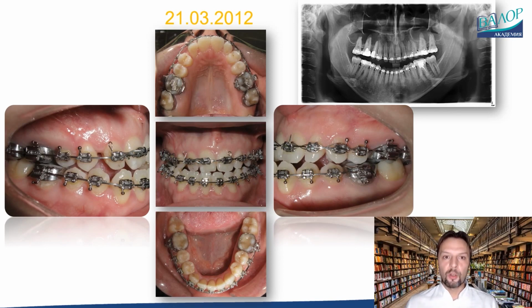This is an obligatory stage in any of my treatments to analyze what corrections are needed to finalize it. Control impressions are of utmost importance for orthodontic-surgical treatments because the models show how the dental arches will fit during the surgery. The task of the orthodontist is to align teeth in such a way to achieve maximum intercuspidation and normal transversal and sagittal occlusion in surgery.